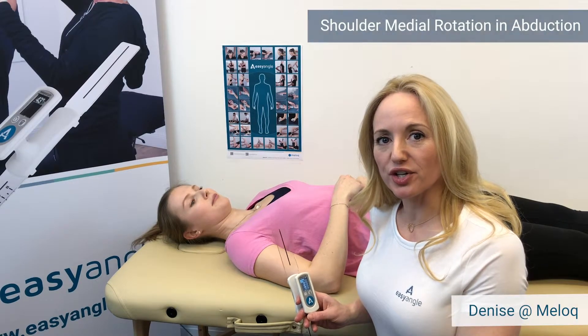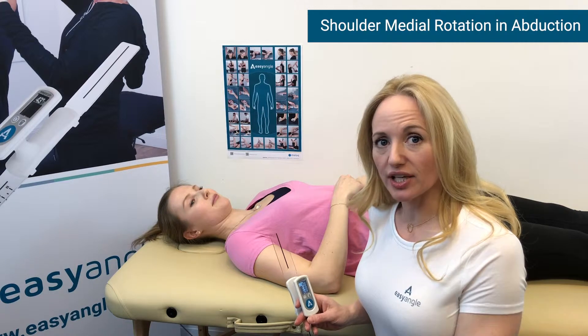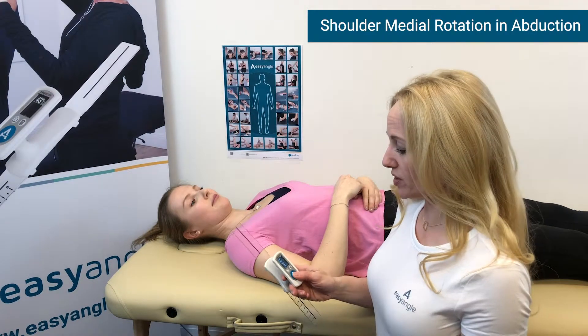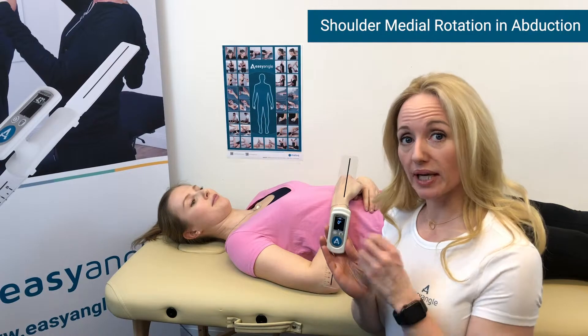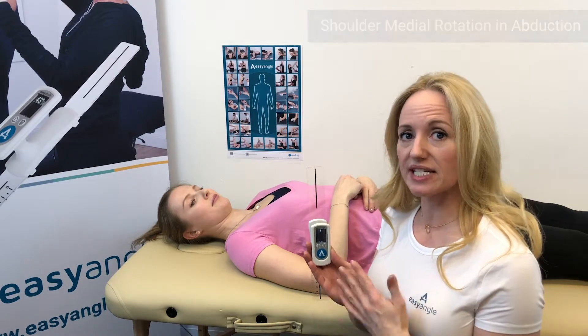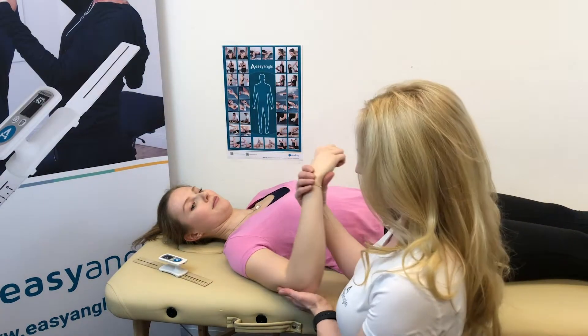In this Easy Angle video, we are going to show how to measure shoulder medial rotation in abduction. To do that, we first press the button so that we get blinking zeros, then we know that the device is ready for setting the plane of measurement. We just place the device to one side.